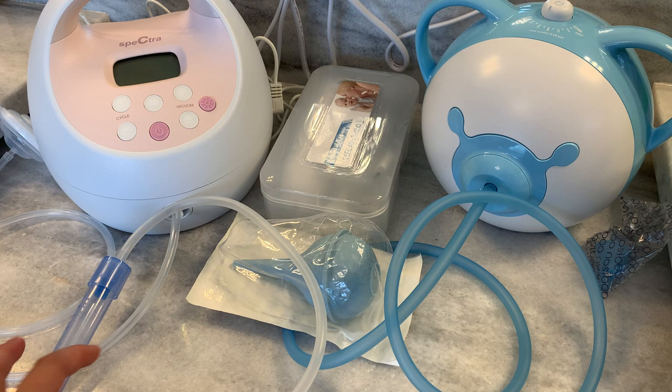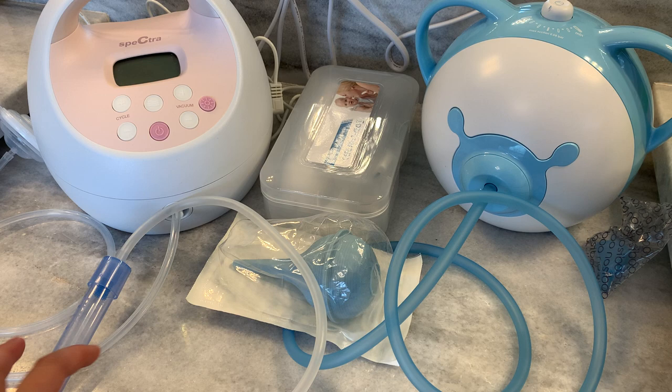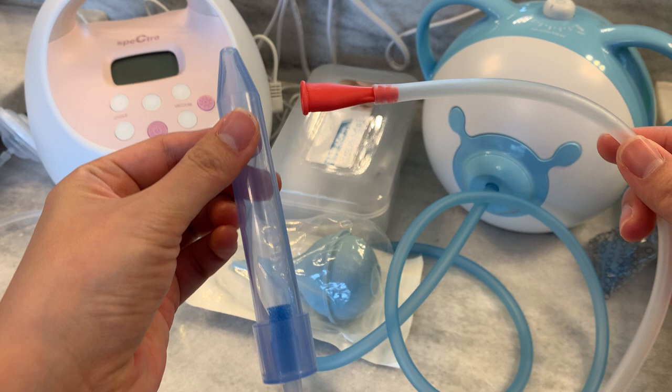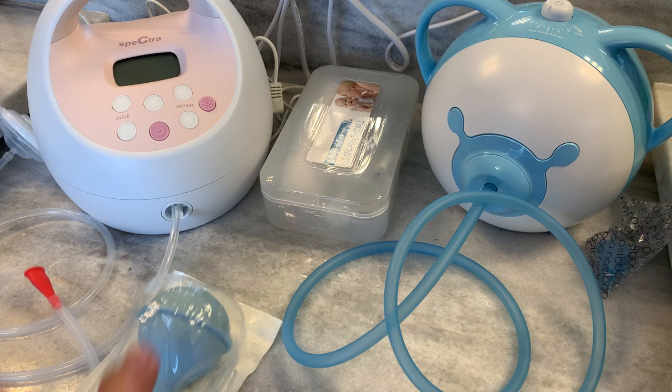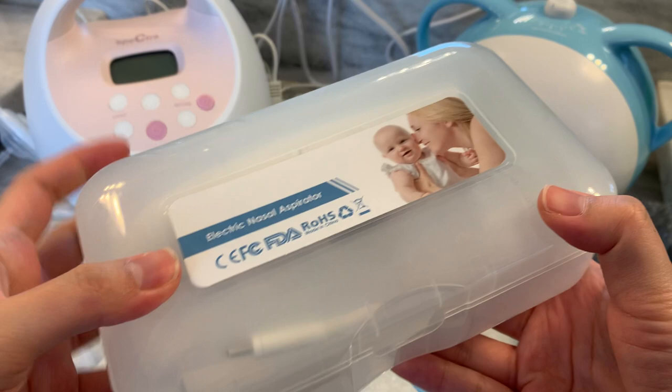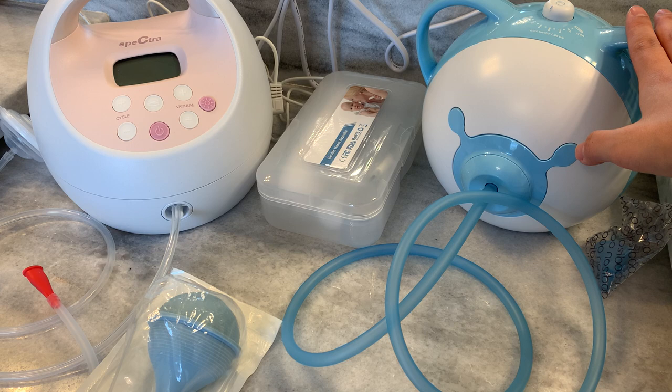The products we'll be reviewing today are the Frida — both by traditional method and when connected to a breast pump — a suction bulb that you get when you come home from the hospital with baby, a small portable electric nasal aspirator, and this large Nozebu electric aspirator. Before I start, I'm not paid by any of these companies, so I'm just reviewing these products based on my experience sucking out snot.